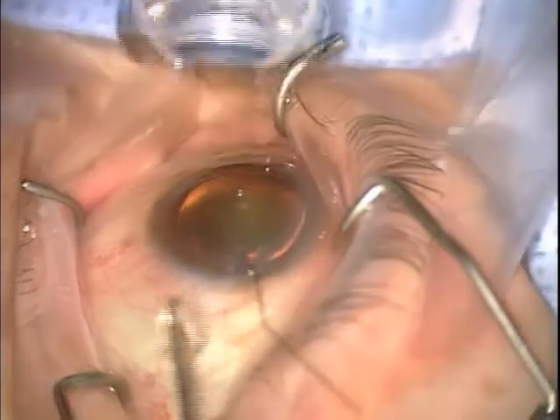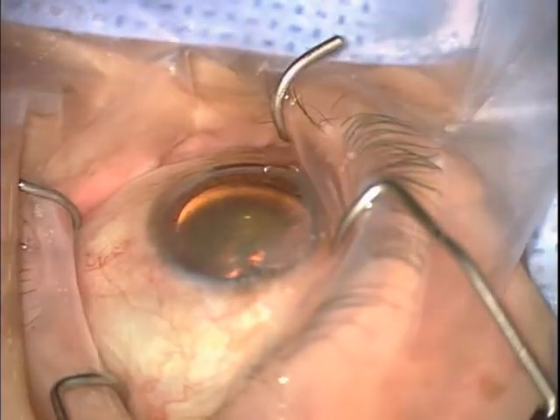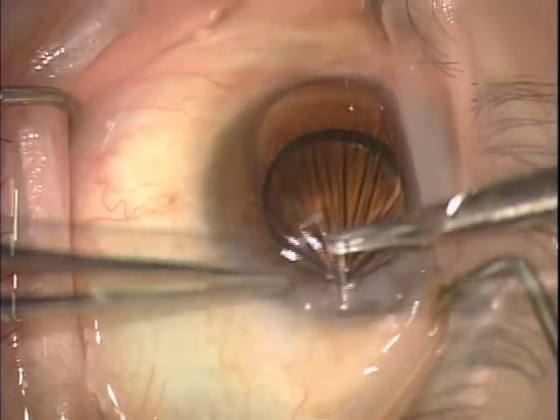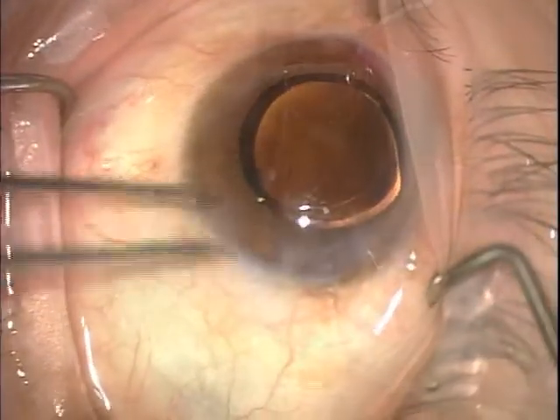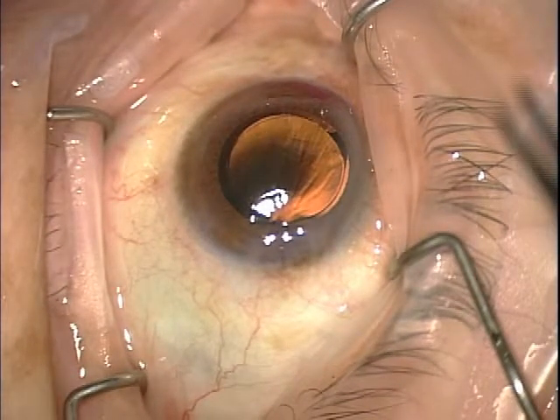At the end of the procedure, a suture is placed. There is a washout with BSS of the anterior chamber, blood and/or viscoelastic, and an air bubble tamponade can be used to prevent further bleeding.